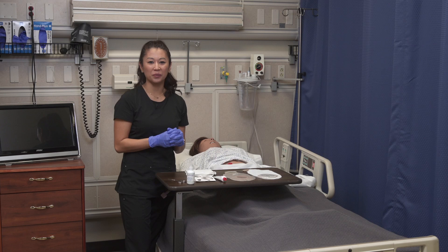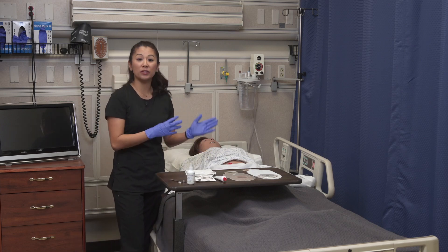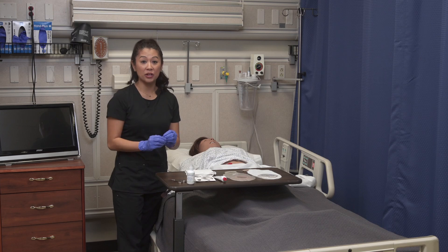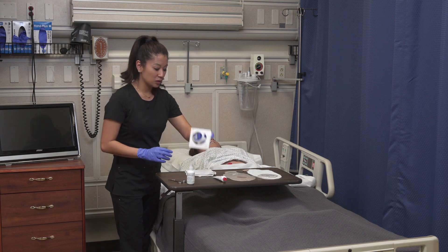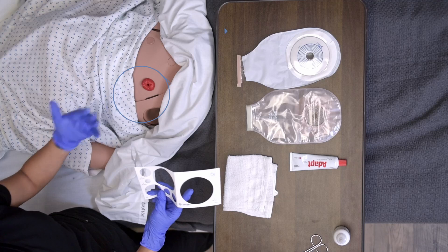Now we can go ahead and get started. We've already removed the old soiled ostomy pouch. Before we begin, don't forget to measure — this is key because it's going to matter where we cut our devices. We're going to take our measuring device and measure the stoma.